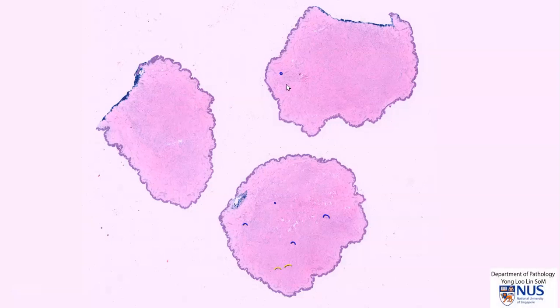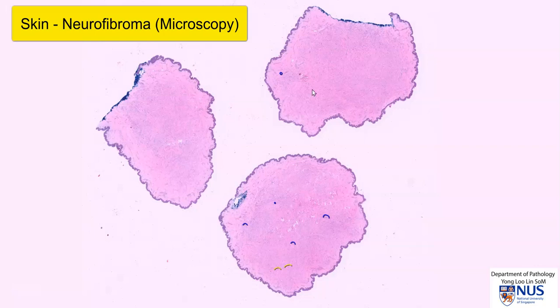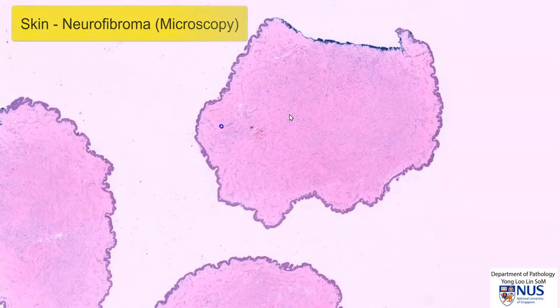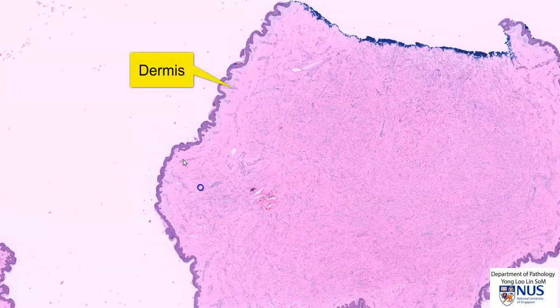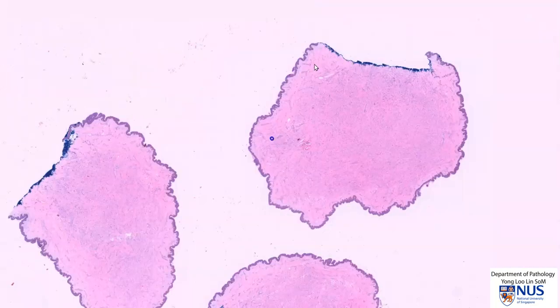This is a virtual microscopy slide of a neurofibroma, and this particular tumour has been cut into three slices. The overlying epidermis is uninvolved and normal. Just beneath the epidermis is the dermis. This central, ill-defined, slightly darker area is the area of the lesional tissue.